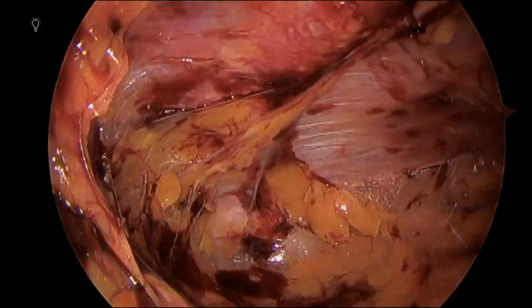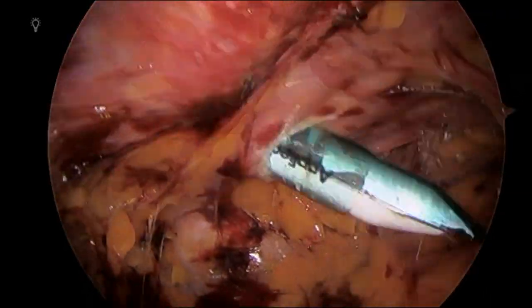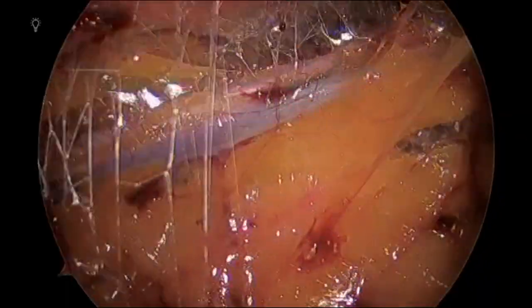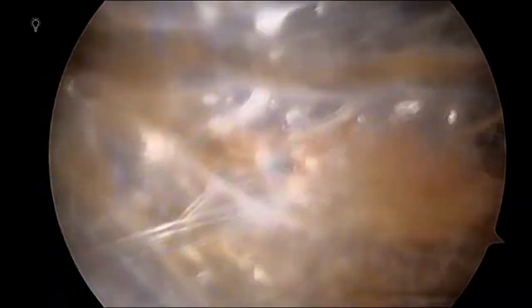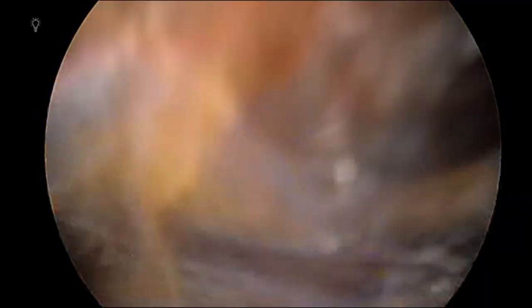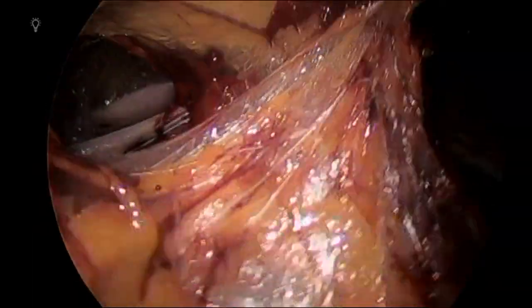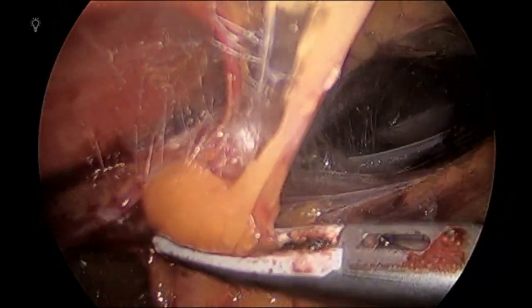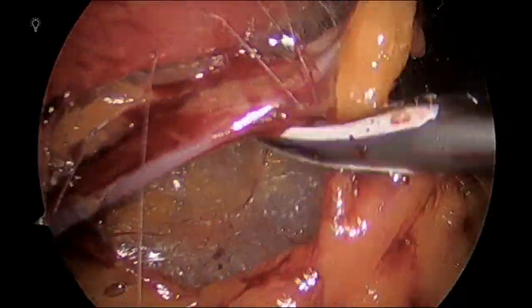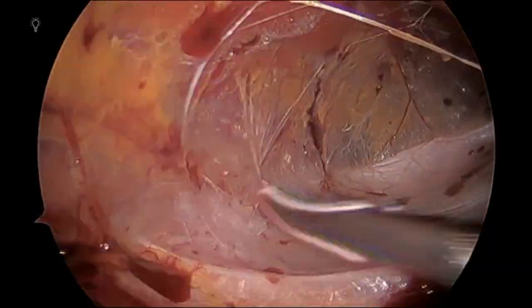Once I'm comfortable with the dissection that I did, I introduce a 10 millimeter port right in the midline to continue my dissection of the right side. I know that there are the epigastric vessels and I perform my dissection right underneath them with the 5 millimeter scope until I see the right retrorectus space. And I continue this dissection until I'm comfortable to introduce energy to continue my dissection and create this space to introduce my last 5 millimeter ports from my left hand.